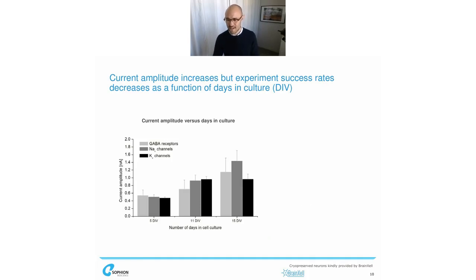Well, okay, that was unfortunate. There was an animation here on the right side, and that should have disappeared. Jane gave me a warning that this has been transferred in a picture, but unfortunately I missed that one. So I'm describing with words what happened here: unfortunately we have an inverse relationship with the success rate, such that the longer we keep those cells in culture, we see a decrease in the success.